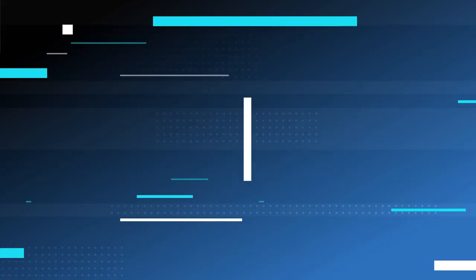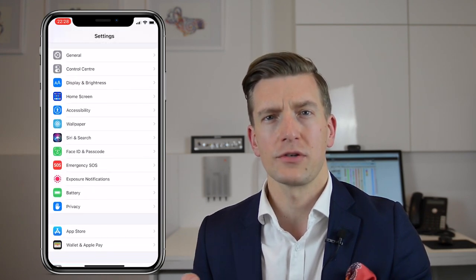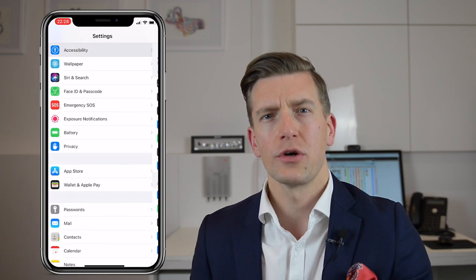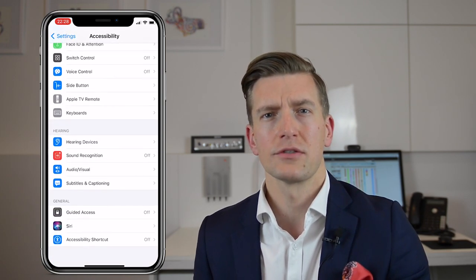Step one. What I'd like you to do first of all is find the iPhone settings app. Following that, scroll down and you'll come across Accessibility. When you go a little bit further down, you'll then come across the Hearing Devices menu. So click on there next.